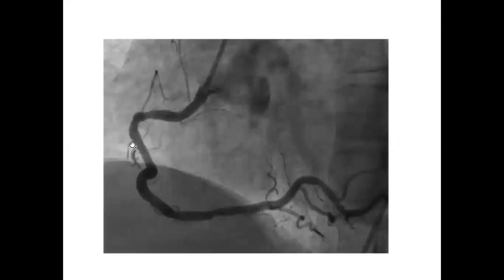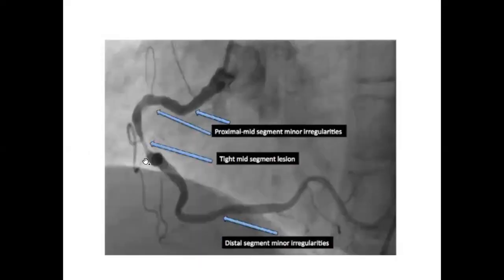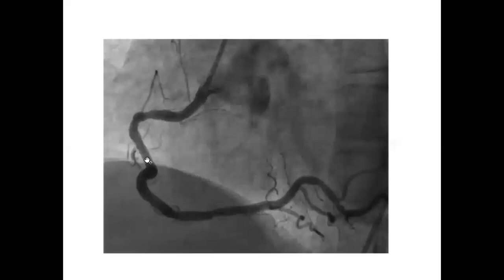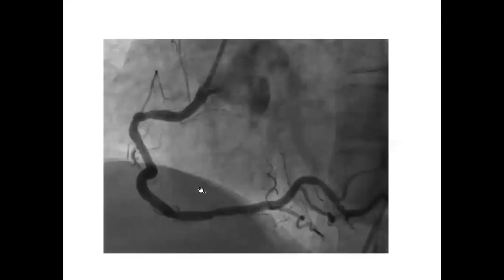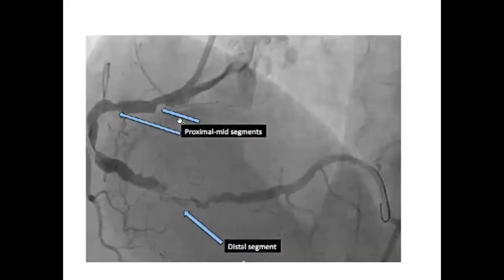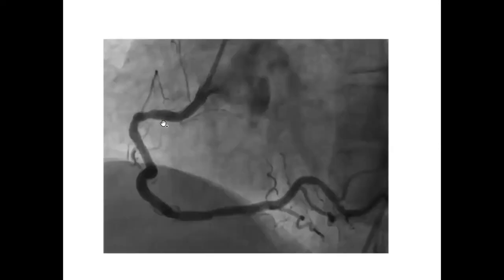A stent was placed in the mid segment where the true lesion was. After placing the stent and removing the wire, you can see that the concertina effect — the irregularities in the proximal and distal segments — disappeared automatically. You should be aware of this effect, because you may assume those are lesions and treat them with a stent, which is not actually required.